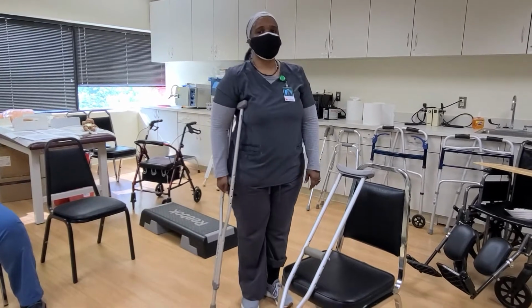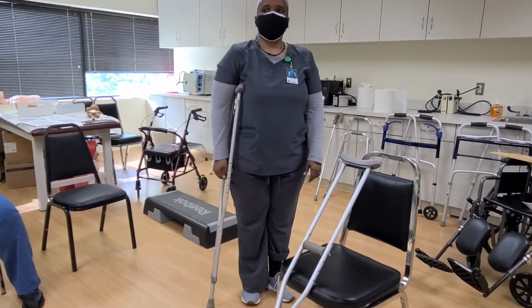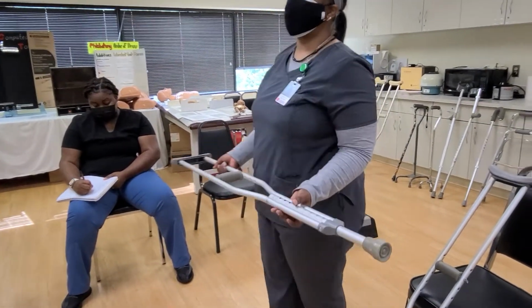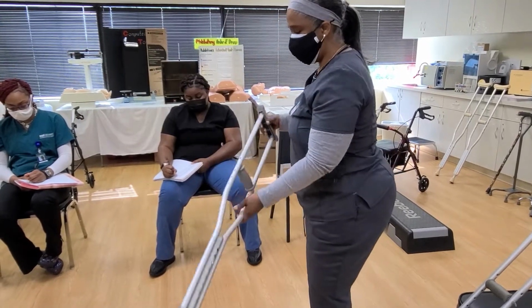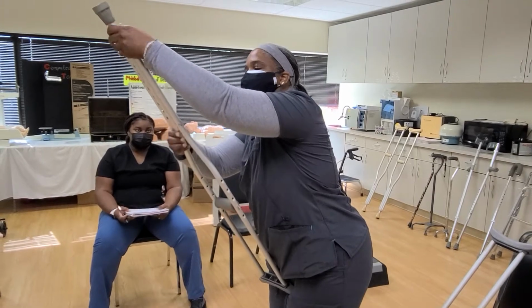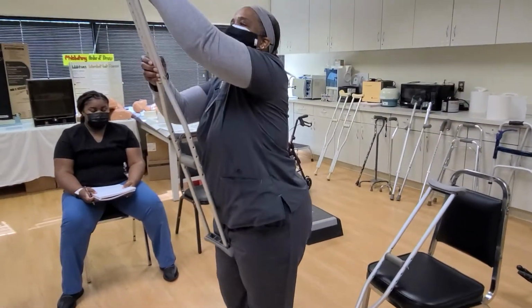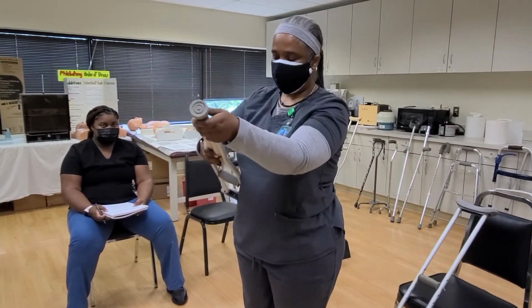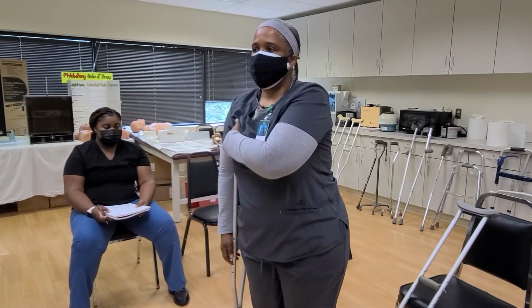The second thing I'm going to do is measure according to my wrist, okay? And so I may need to adjust this. As you can see, it's a little too low for me, so I need to raise it. This one says 5'5". Now you can ask your patient how tall they are, but this is not really accurate. So I'm going to put it at 5'4", because I believe 5'3" is going to be a little too short for me. Nope, 5'3" looks like what it is. Oh, I'm 5'2"? No, say it isn't so. All right, let me put it back to 5. No, let me keep it at 5, because what I really want is this. Okay, all right, that's good.